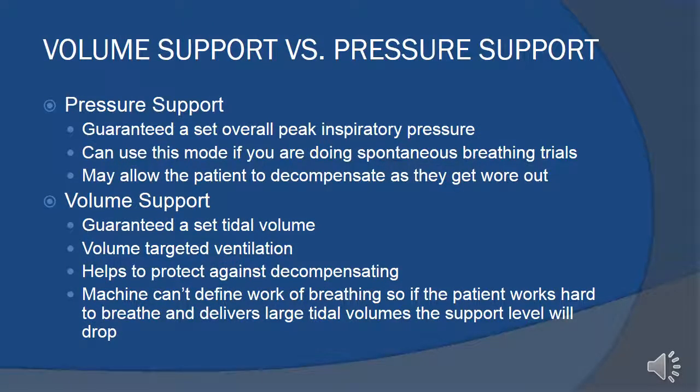What I want to do is do a little comparison of volume support versus pressure support. It seems that most institutions use pressure support ventilation, and many people have no idea really what volume support is or what it does or why they may want to use that over pressure support. Now, pressure support, of course, guarantees that you can have a set overall peak inspiratory pressure. So if you're concerned with high pressures, this is going to help protect those pressures from getting too high. And you can also use this mode if you're doing a spontaneous breathing trial. You can't use volume support if you want to do this.